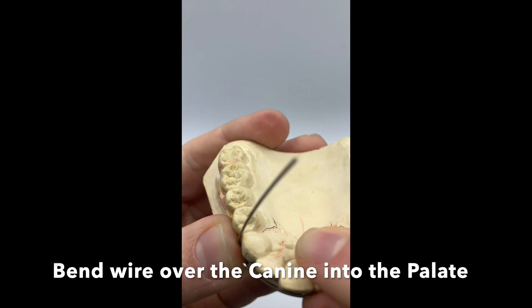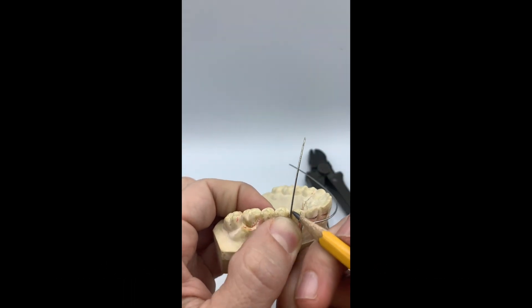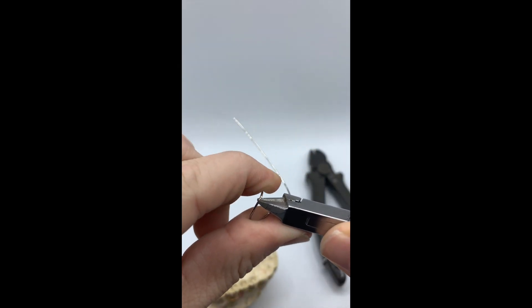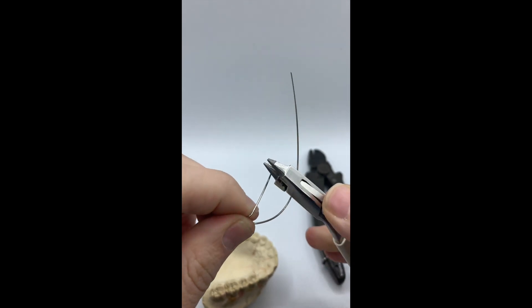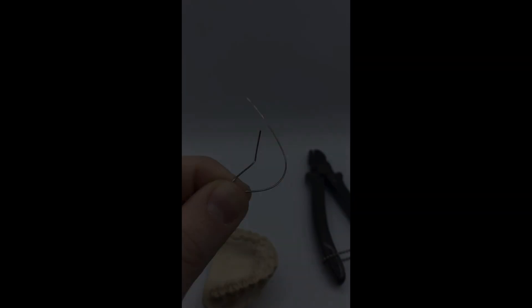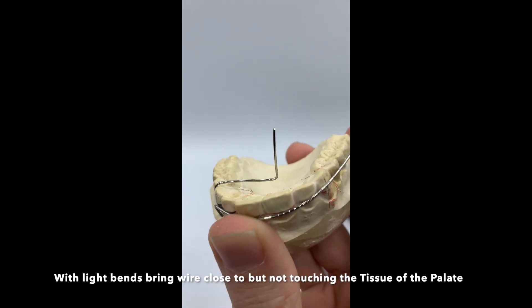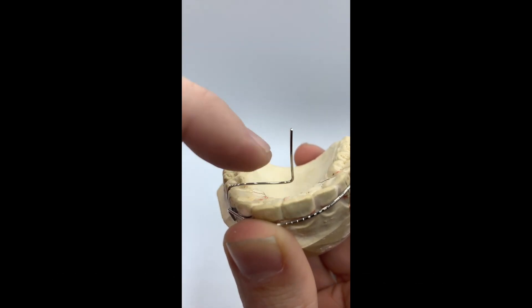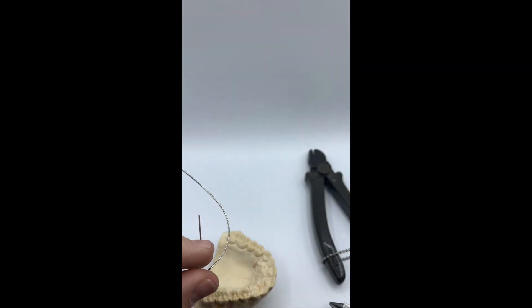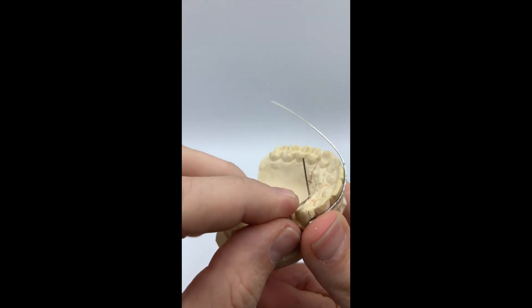Once the wire is touching the canine, we want to now bend the wire into the pallet. You can mark on the wire with a carbon marker or pencil where you have to bend. A short series of bends, you want to bend the wire towards the pallet. If you bend too far down, the wire is going to touch the pallet and not allow the wire to sit properly. Then, just unbend it.